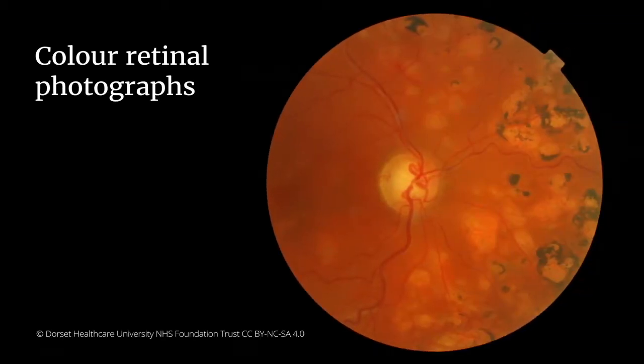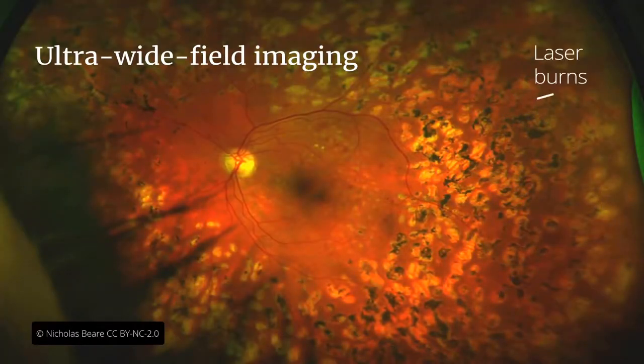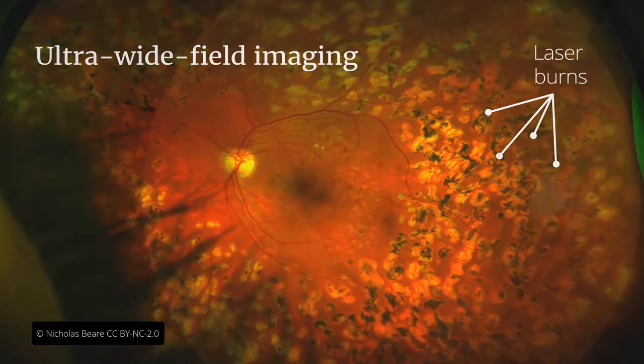Colour retinal photographs taken at screening are useful for counselling patients and following up the effects of treatment, for example from lasers. They are not that good for monitoring diffuse macular edema. Modern wide-field retinal imaging can identify more peripheral neovascularization.